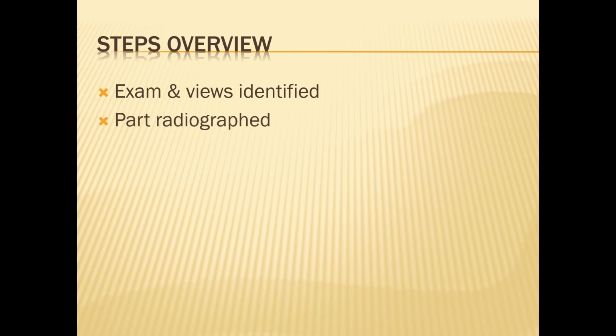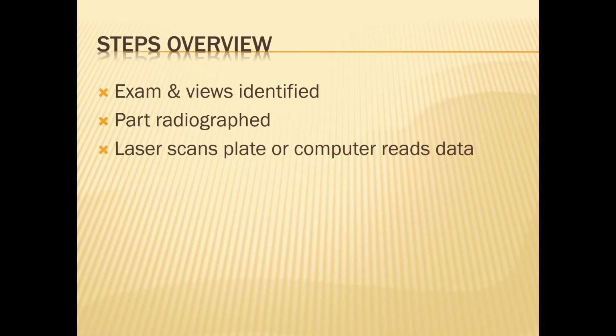With the patient prepped and the exam room ready, perform the examination. If using a CR system, make sure the cassette holds the correct image, and if a DR system, assure that the image that is captured is properly identified. For a CR system, it is now time to have the PSP plates scanned. For a DR system, the imaging plate is automatically scanned and the image stored in the computer memory between each image acquisition.